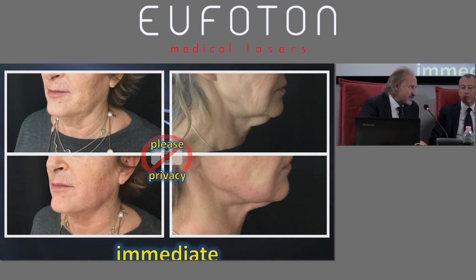I prefer saying stability and not traction threads, because you can get traction with some very painful sequelae. After some days, 15, 20 days, or even longer than 20 days after Endolift, I may use threads with some anchorage to stabilize, to help compaction. That's quite effective in my view. These threads go backwards to the lines of the Endolift, making this compaction easier. It's going to be very beneficial in my view. Okay, these are the protocols I use.